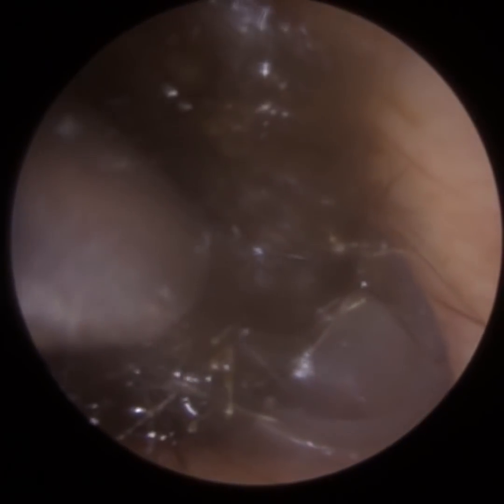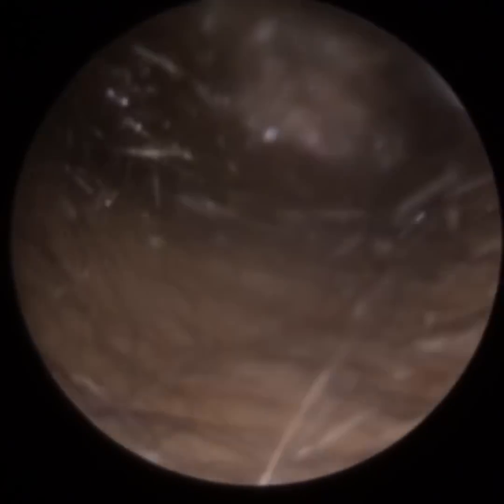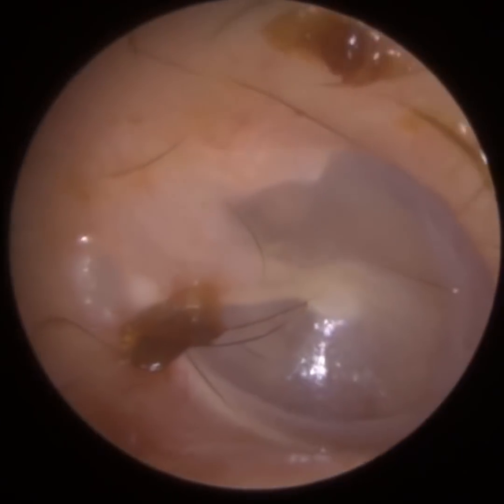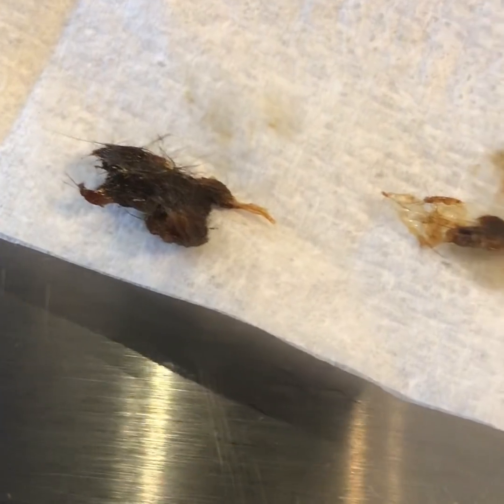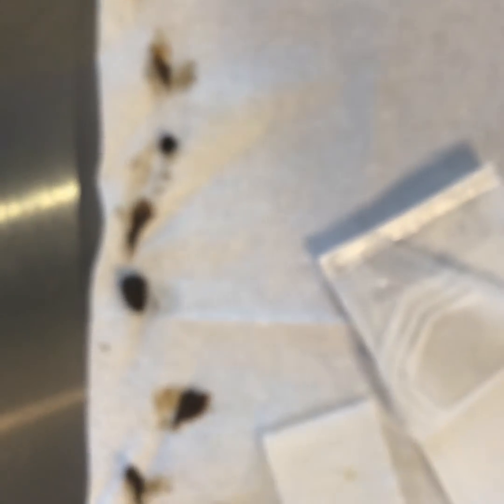There's just some remaining wax superiorly on the eardrum — I'm going to remove that. If you over-oil your ear or overuse other types of drops, like bicarbonate or hydrogen peroxide, the wax actually absorbs the drops, expands, and swells. There's a little speck of wax on the hammer bone — I'll leave that because the patient was a bit anxious and it's not going to improve their symptoms. That's all the contents from the ear. You can see just how dark that earwax is. I hope you enjoyed that video!